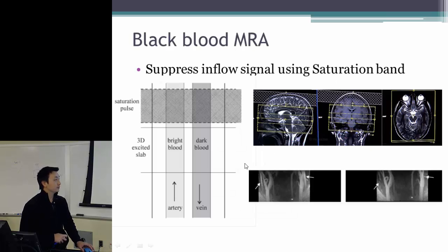Another simple idea of suppressing the inflow signal is using the saturation band. This one has the TOF effect.